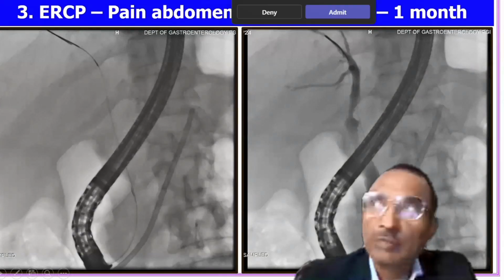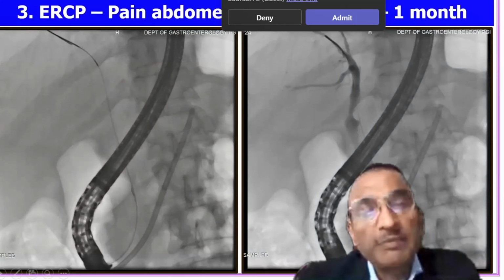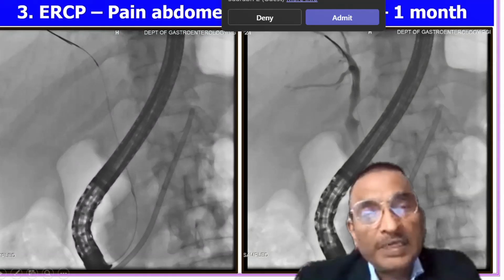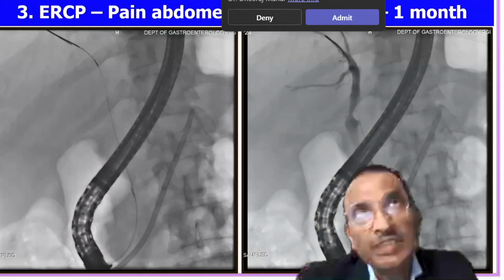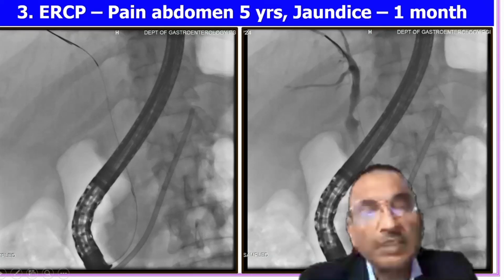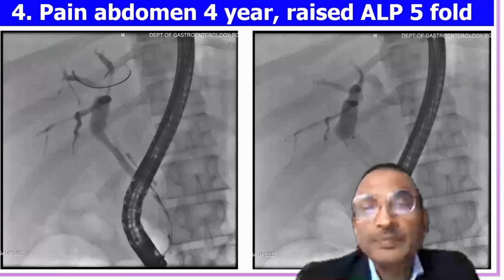For bile duct benign biliary strictures, most of the time the target diameter is 27 to 30 French. But that will not be achieved in the first session because that will lead to extreme pain in the patient. So first we place 10 French or 14 French or 17 French, so mainly 1 or 2 stents, and then in subsequent sessions it will be upgraded to 27 or 30 French. So that will be done in patients.